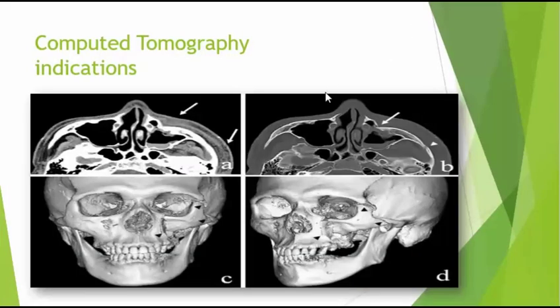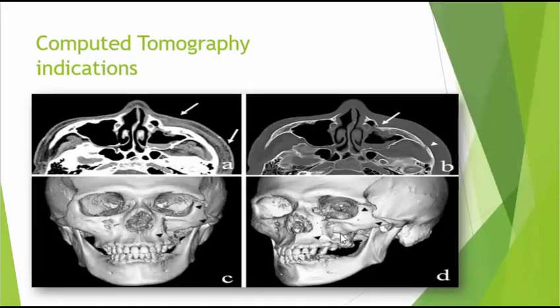In this slide, we have a zygomatic complex fracture with inward displacement of the zygoma and involvement of the lower margin of the orbit. This is the area of fracture of the zygomatico-maxillary suture, and this is the area of zygomatico-temporal suture fracture. In this 3D image, we have a better view of the fracture. This is the zygomatico-maxillary suture fracture. This is the zygomatico-temporal suture fracture, and here we have a fronto-zygomatic suture fracture. This 3D image has simplified the treatment planning to reduce the zygomatic fracture.